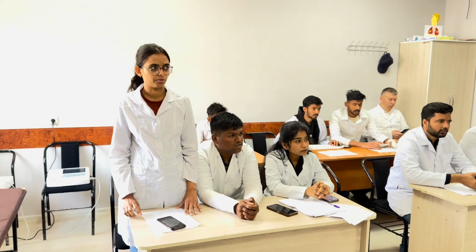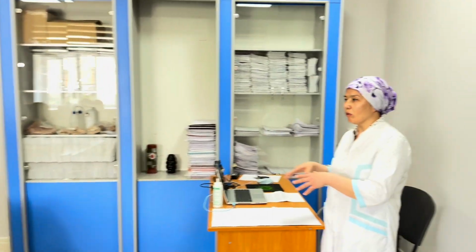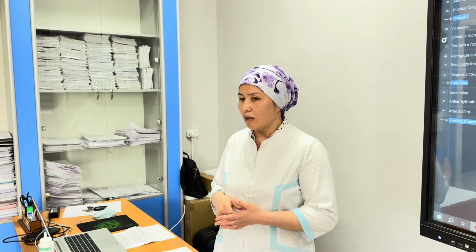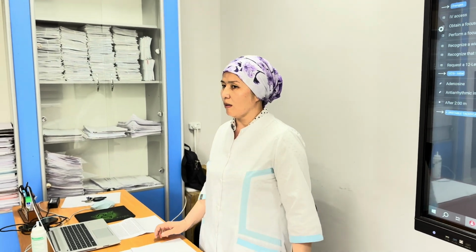Do you agree, guys? Yes, of course. Arrhythmia means we can see a slow or rapid or fast rate. Here we can see on the ECG, and the ECG tells us exactly which type of arrhythmia. That's why we use the ECG apparatus.